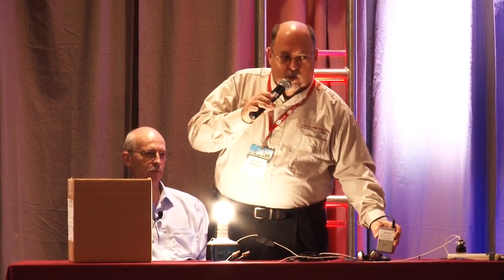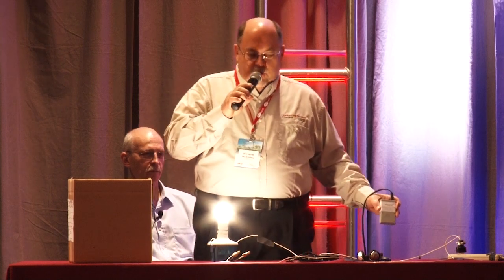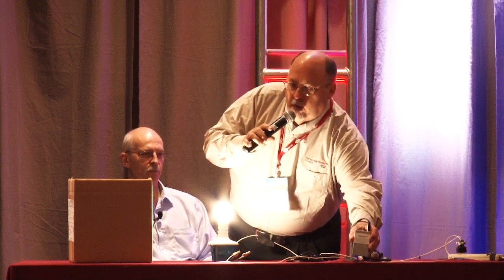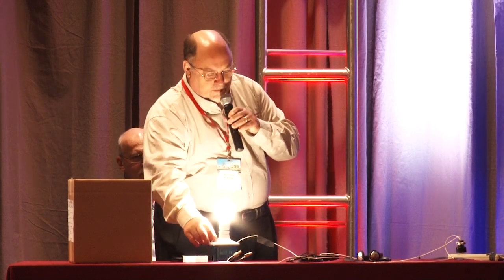It nulls. If you hear it, when I go right over the wire, it's gone. Same thing with detecting a loop system. But here's the trick. There's not just one. If I go over this side, I'm going to null. I go over this side. Okay, you can turn this off. I'll get rid of this fancy interference system here.